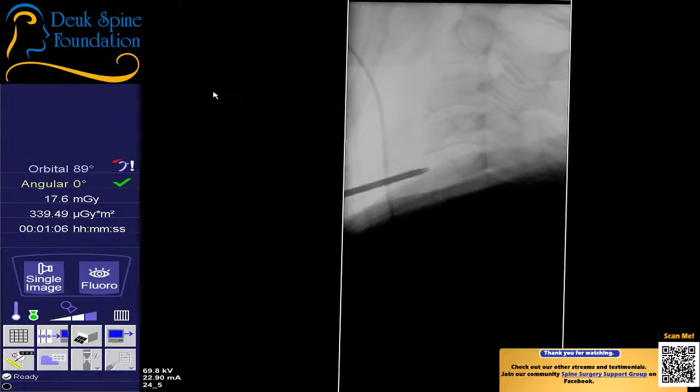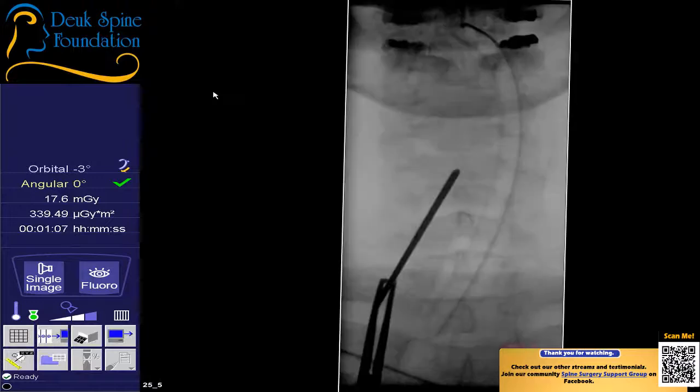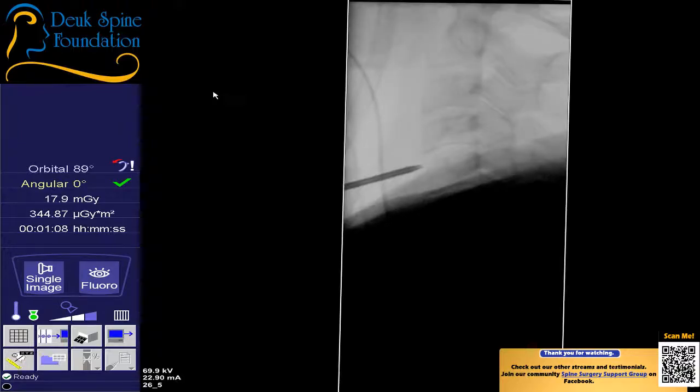That felt pretty good. I want to go a little more. Give me an AP right now. Yeah, don't manipulate her at all. I'm almost done. Shot. God, that's perfect. Back to a lateral. So we are just about to enter the C4-5 disc. It's the third disc that I'm fixing on this patient today.